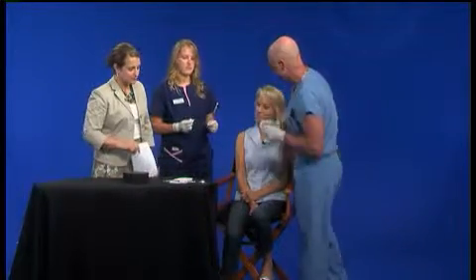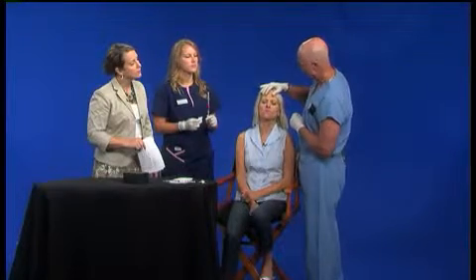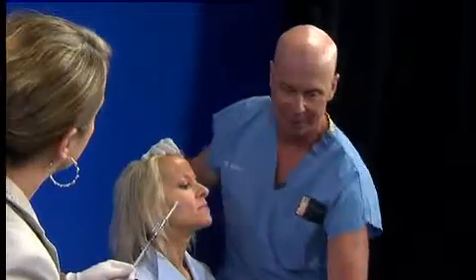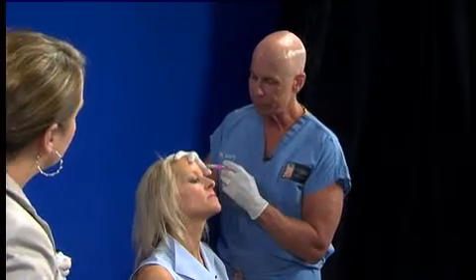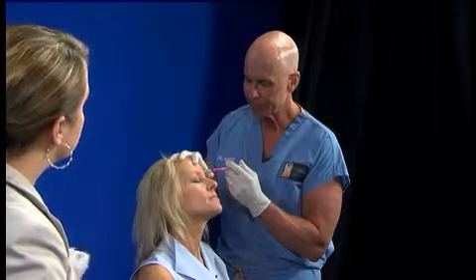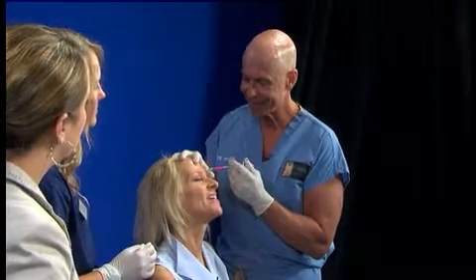Well, let's see this in action. Let's not hold it up. All right, we'll inject Heidi. What we're going to do is we're going to inject her frown lines. Okay. And frown once, Heidi. When people frown, they have these little creases in the middle, and so we'll prep that with a little bit of alcohol. Okay. And again, this is a very, very tiny needle. And what we'll do, it's just a small injection. There it is. It's happening right now. We're doing it. Sorry, shouldn't make her smile. That's okay. Oh, it's all right.